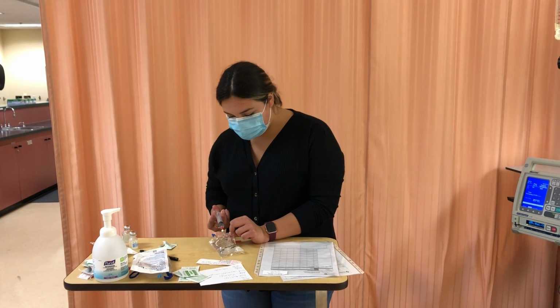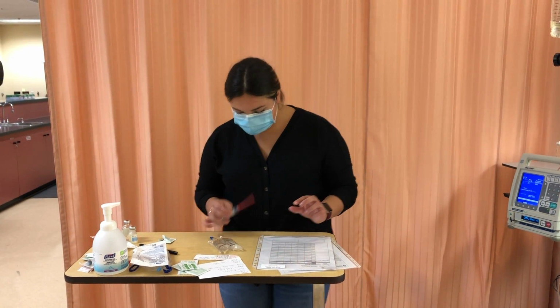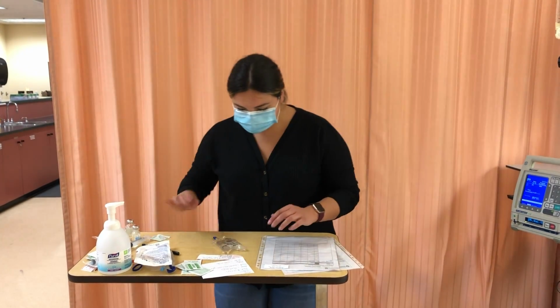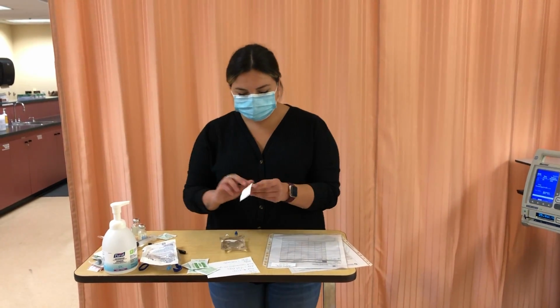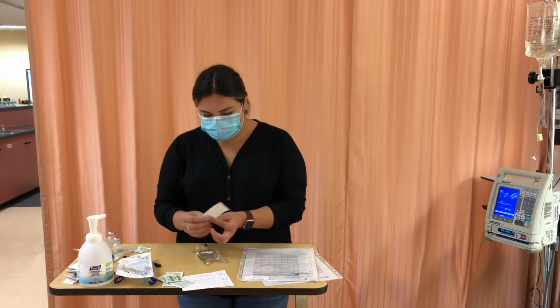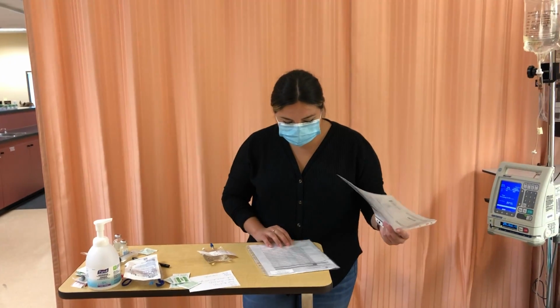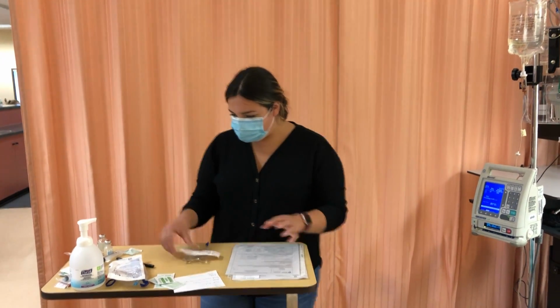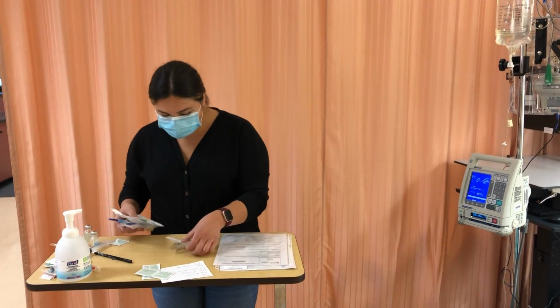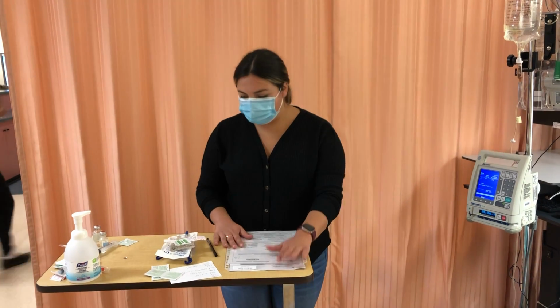And administer my 4 milliliters of fluids. Quickly recap that guy. That would also be discarded. And label my bag. My mini bag is labeled. So then I'm going to go to the bedside and I'm going to take a secondary set, alcohol swab, mini bag, my PDM and my MAR.